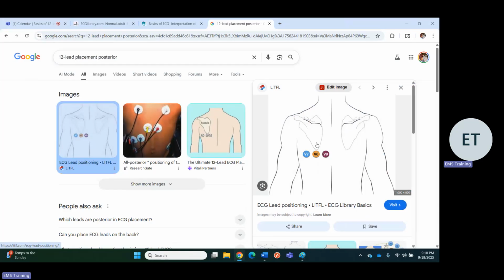And then the patient is probably more likely to lay down on them, which could increase interference and artifact. Furthermore, there's more muscle back here than there is on the rib cage. You're not putting these on the actual chest pectoris muscle, they're below the pec muscle. So these are likely to be more dampened.